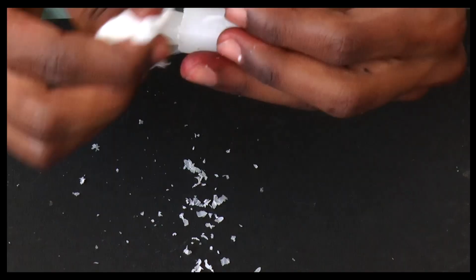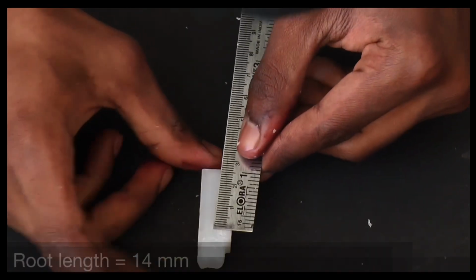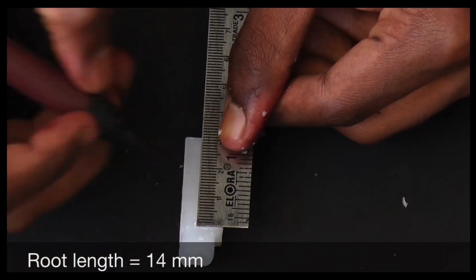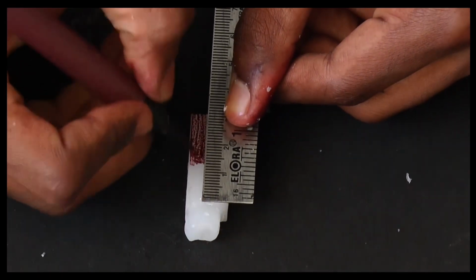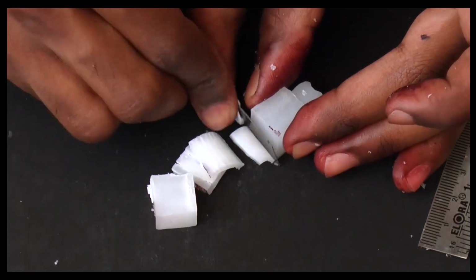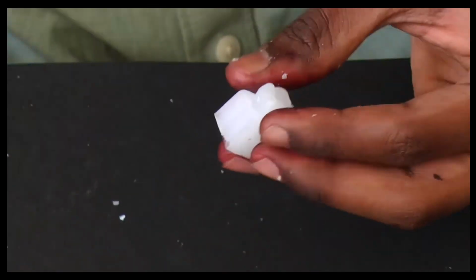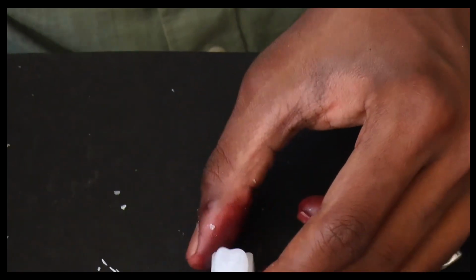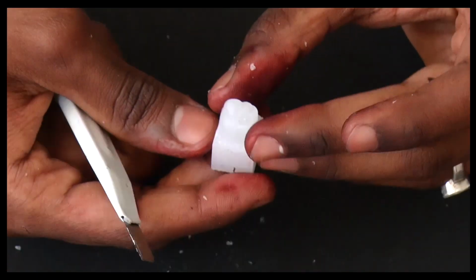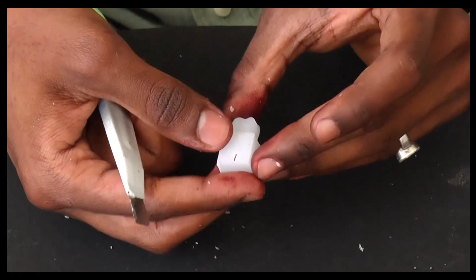We are done with the crown. My root is supposed to be 14 mm, so let me take a 14 mm mark here. Okay, let me carve out the extras. First, it's very crucial to know that it has two roots and both of them are distally bent.